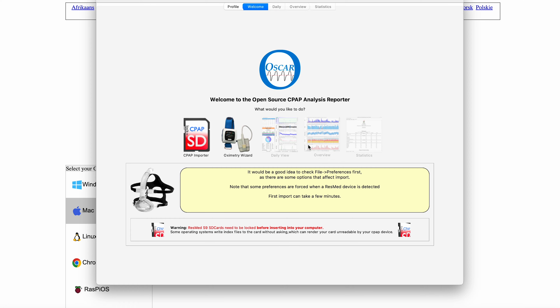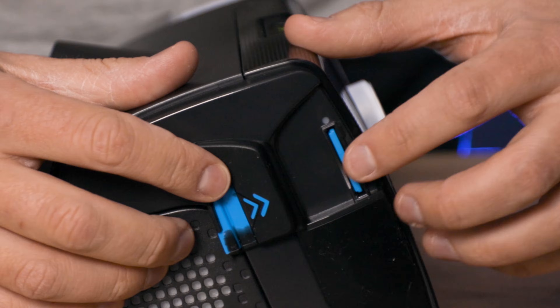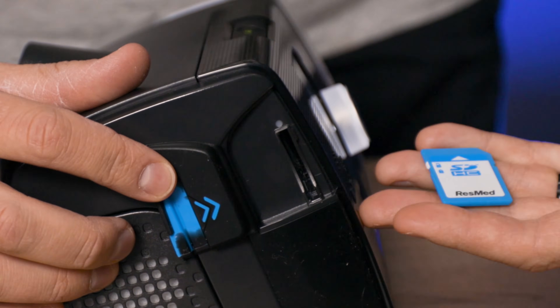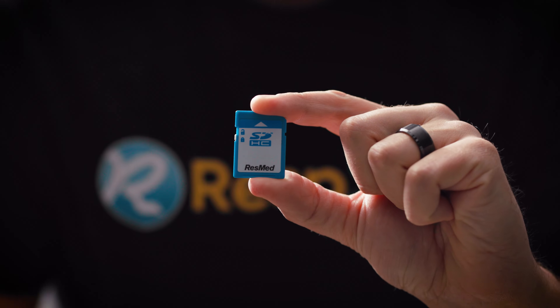Now you'll see a series of icons in the middle. The last three will be grayed out right now because you haven't brought your data into Oscar yet. So let's get that sorted. Go to your CPAP machine and remove the SD card — it stores your data. If you use a machine without an SD card, like ResMed's Air Mini, you won't be able to use it with Oscar, unfortunately. But once you have your SD card safely in your hands, you need to make sure your data stays safe too. So check to see if your SD card has a small switch on the edge of the card and make sure it is in the locked position. Basically, this makes sure the data on your card can't change, so there's no chance of your computer adding a file to the card that stops it from working when it's back in your CPAP.